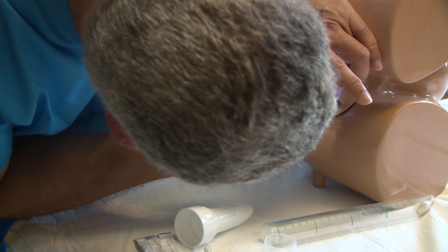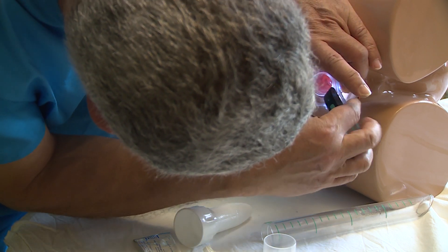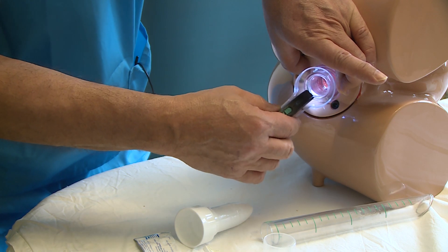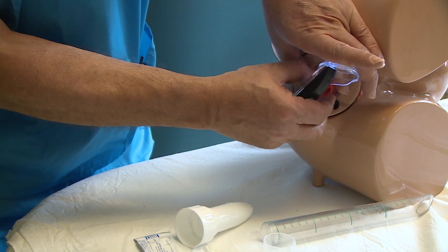By rotating the proctoscope we can now view the first hemorrhoid, the second hemorrhoid, and the third hemorrhoid. When finished, the proctoscope can be rotated against the mechanism and it will easily come out.